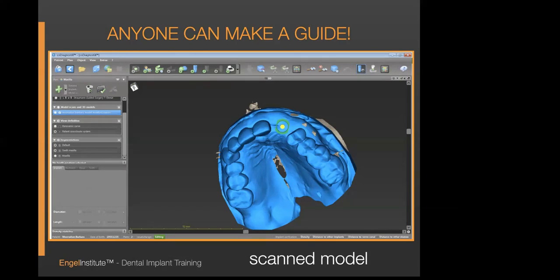I had to figure out where I was going to put my implant. I don't know if I finished my thought. That is, I always personally cantilever mesial, okay? We can go to the physics later, but I cantilever mesial, and we'll get into that. But I decided that I was going to put the implant under the canine.